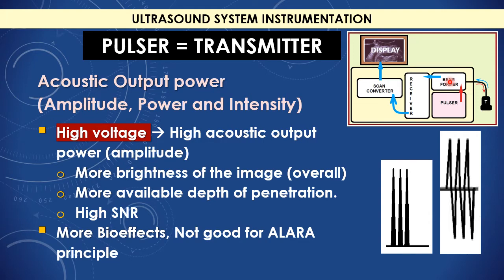Especially if you are scanning an OB patient, bioeffects are very sensitive here. So the more bioeffects, yes, if I'm having high output power. So in this condition, what I need to do is go for a good ALARA principle. What is the ALARA principle? Okay, as low as reasonably achievable, and we'll discuss this in a couple of slides now.